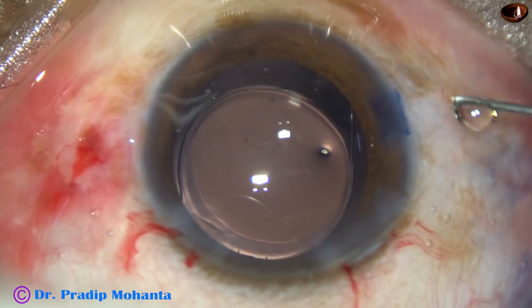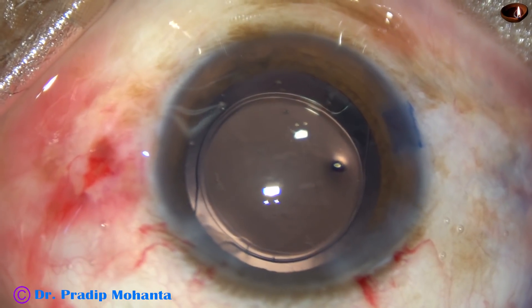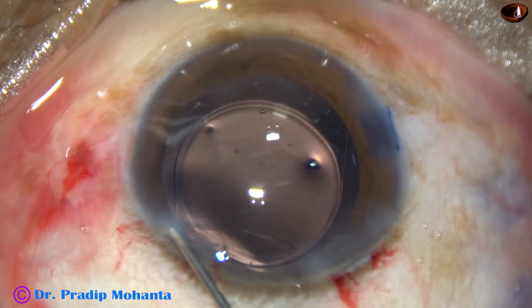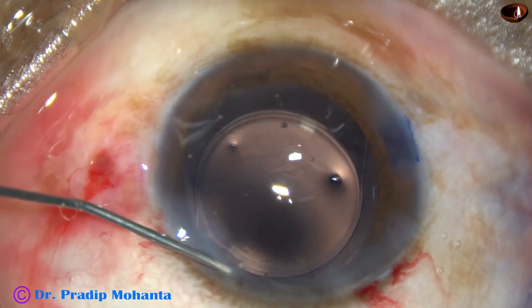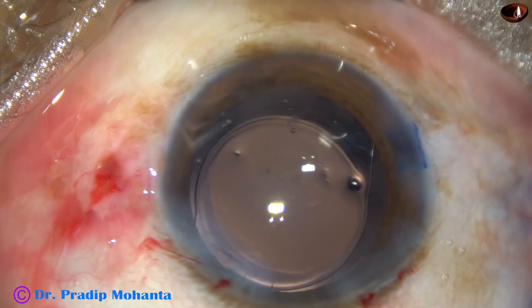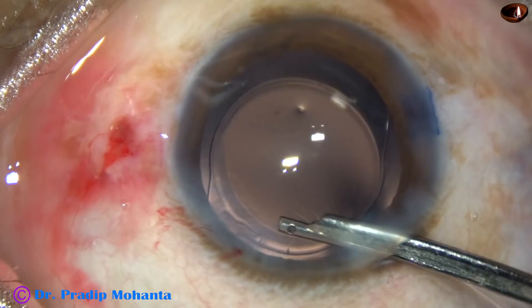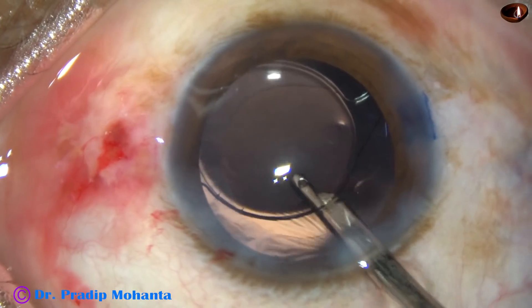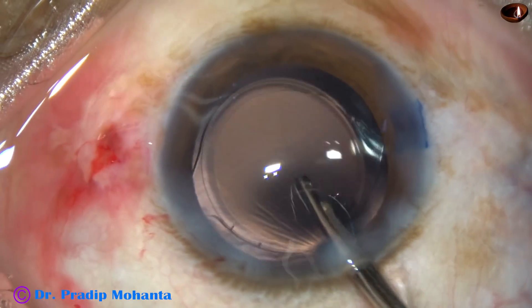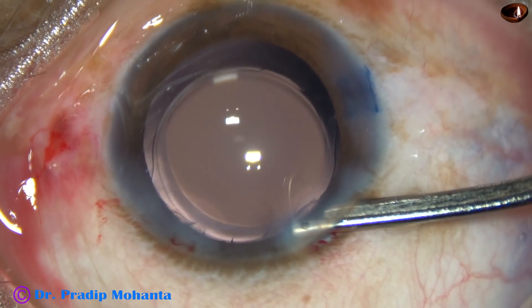Recently, my friend Dr. Gopal Arura showed that we can use only BSS in the cartridge, and no viscoelastic goes into the anterior chamber at this stage. Now the surgery is almost done. The side ports are closed by corneal stromal hydration — the corneal stroma on either side of the side ports is hydrated and these small stab wounds close. And now, this is the final lavage of the anterior chamber: a gentle stream of fluid is directed towards the corneal endothelium, and viscoelastic from the corneal endothelium is cleaned. Yes, it is safe. Now the anterior chamber is formed very nicely and the case is concluded.